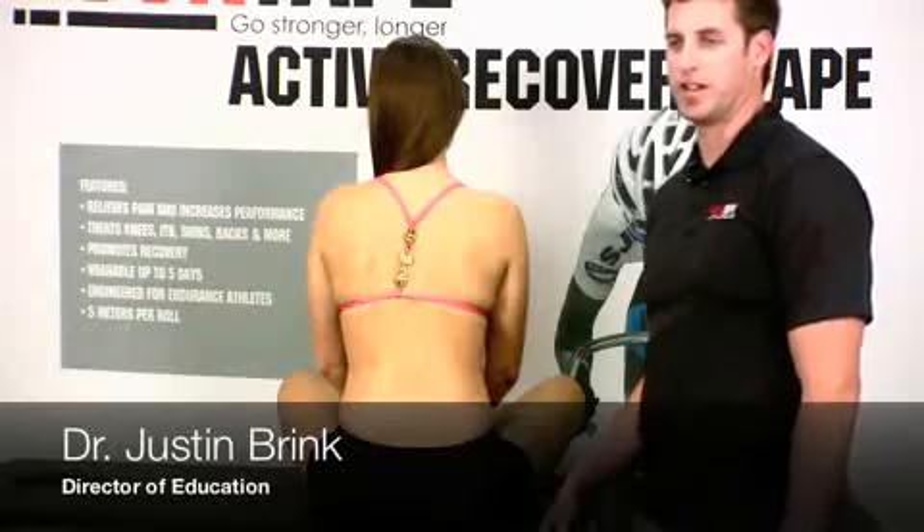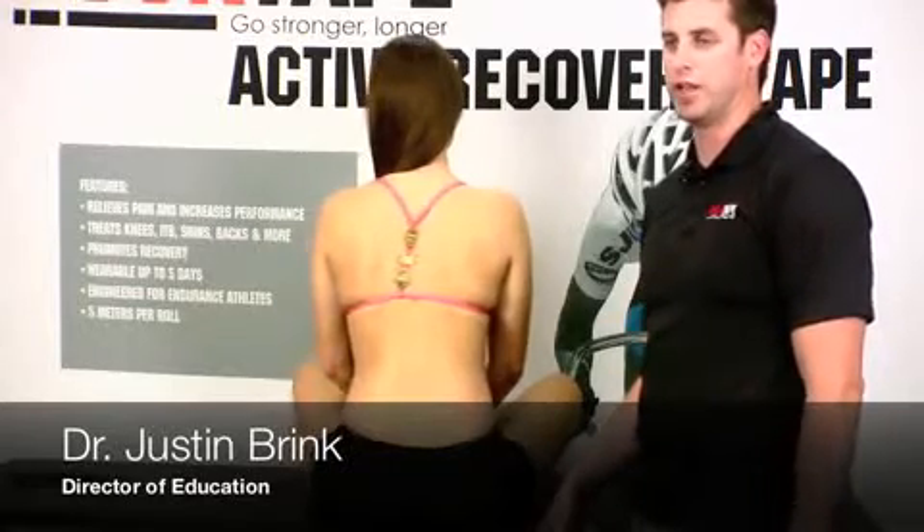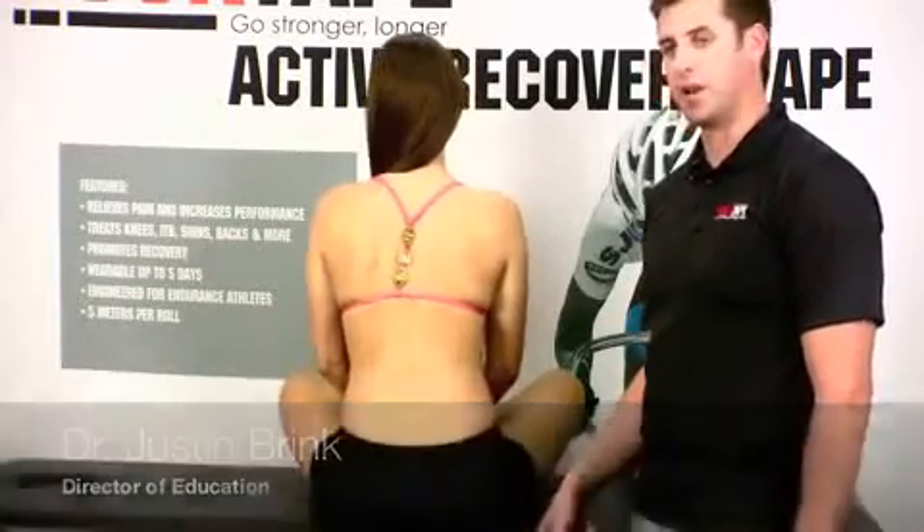Hey there, it's Justin from RockTape. Today we're going to talk about our power taping method using a rehab-based protocol for neck pain or cervicalgia.